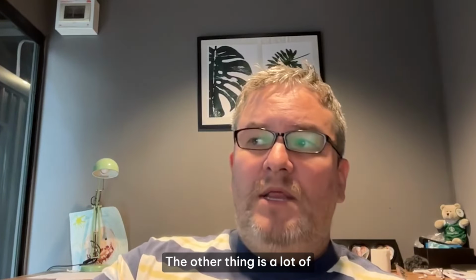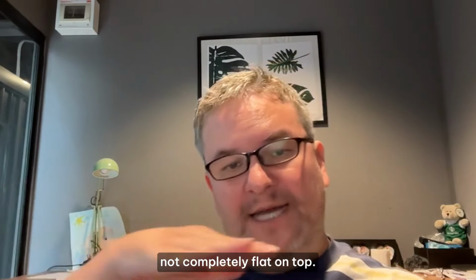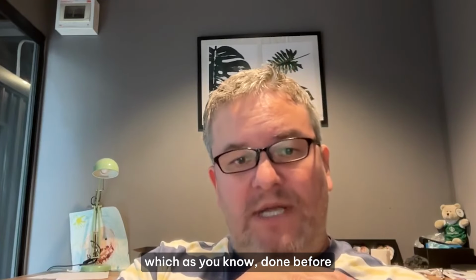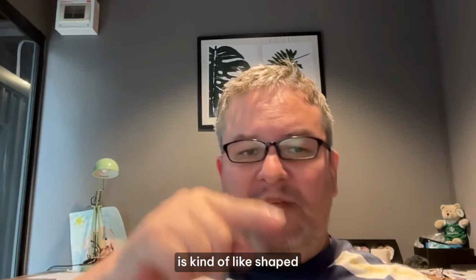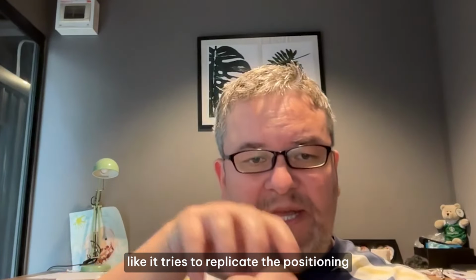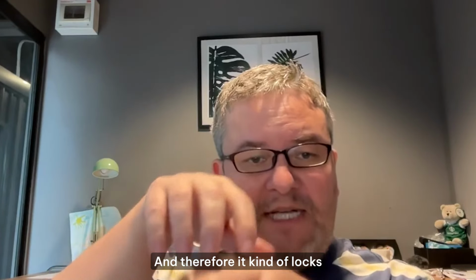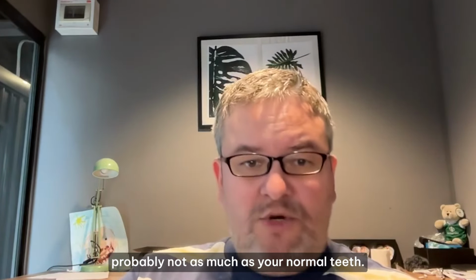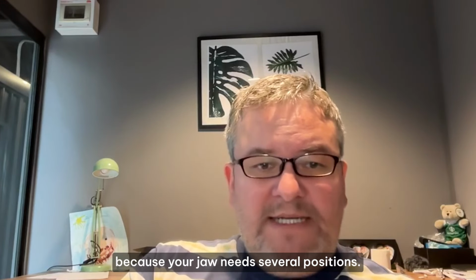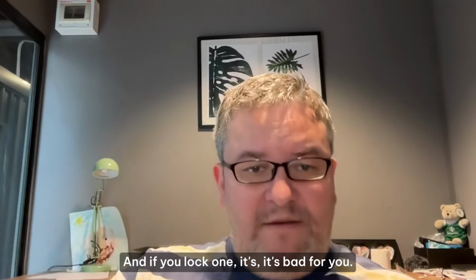The other thing is a lot of these mouth guards are lightly indexed, meaning that it's not completely flat on top. So if you get a lower mouth guard, for example, from J&S Dental Splints, which I've done before, it's shaped a little bit like your lower teeth. And so potentially it tries to replicate the positioning of your lower teeth to the upper teeth, and therefore it locks your jaw a little bit. Probably not as much as your normal teeth. I generally don't like anything that is trying to lock a position because your jaw needs several positions, and if you lock one, it's bad for you.